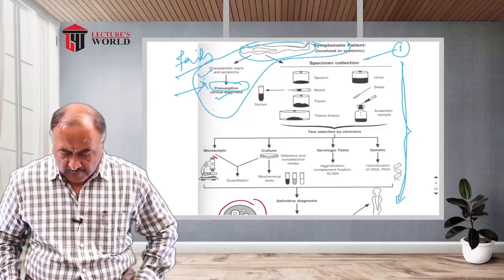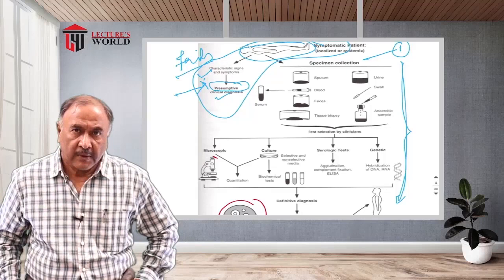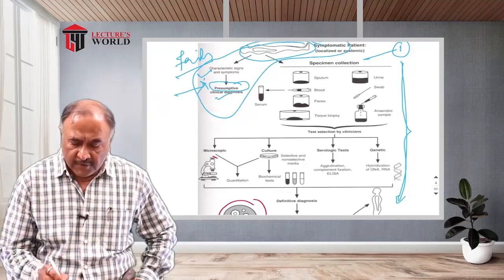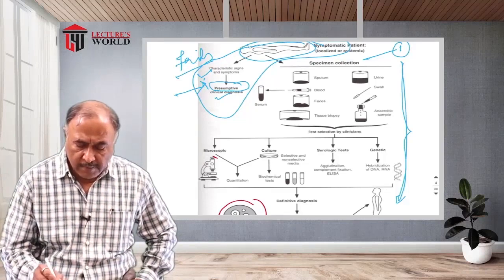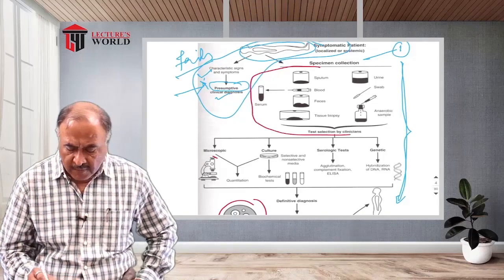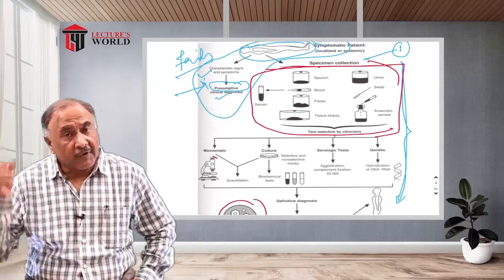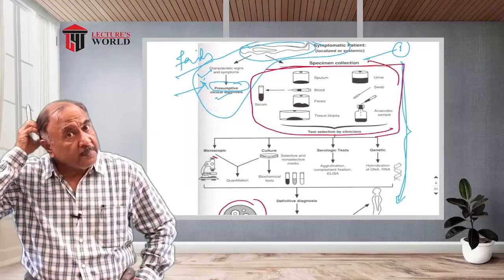So the first step is specimen collection. The collection can be done using many different specimens. It is the choice of the clinical person.